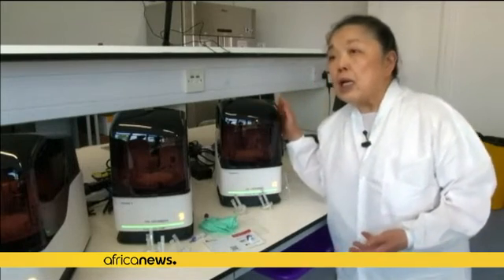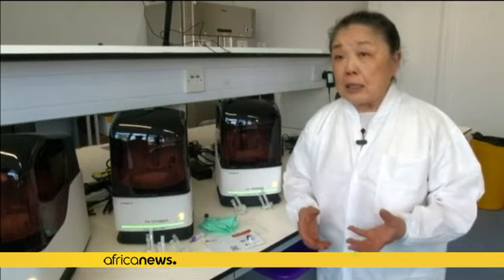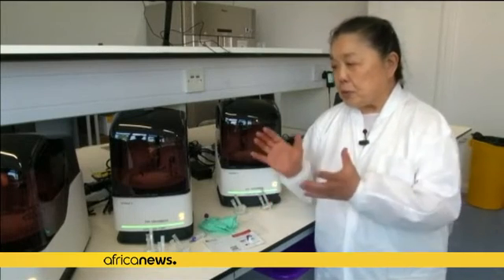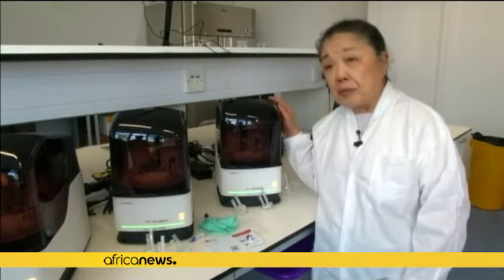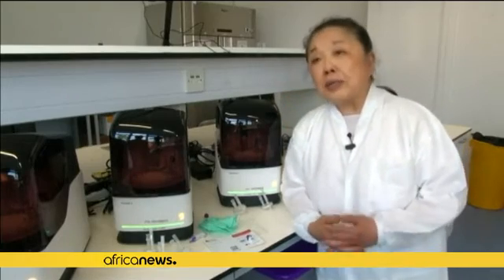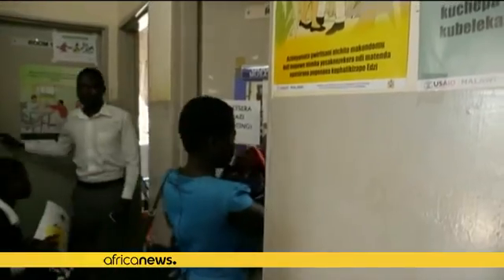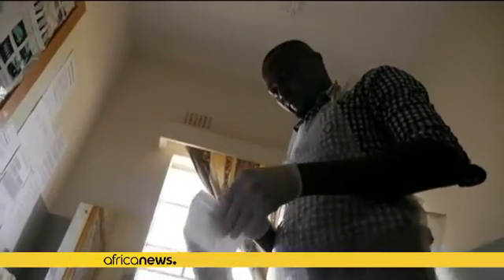Normally this type of testing is done in a machine the size of a mini, and we've reduced it to one the size of a coffee machine that literally anyone can do. Primarily the test can be done by healthcare workers with minimal training.